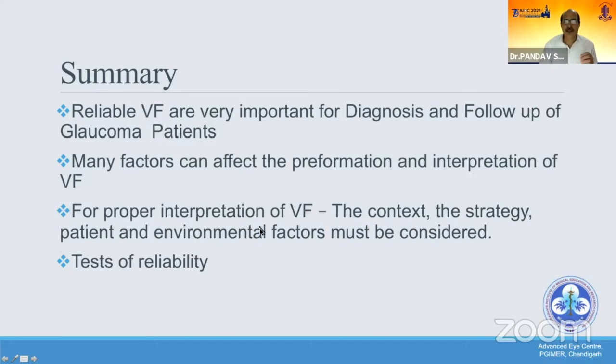And also finally, you have some tests of reliability given printed on the chart. They should be within those limits of acceptability.